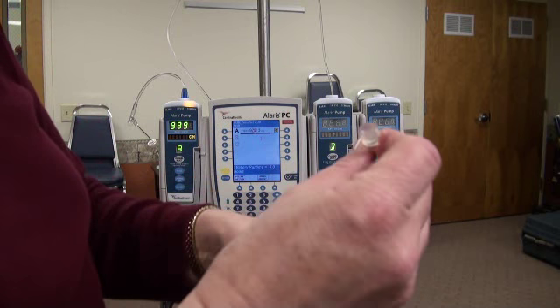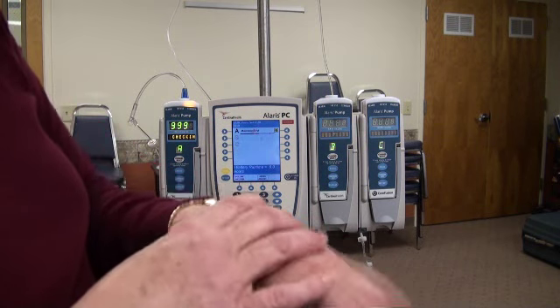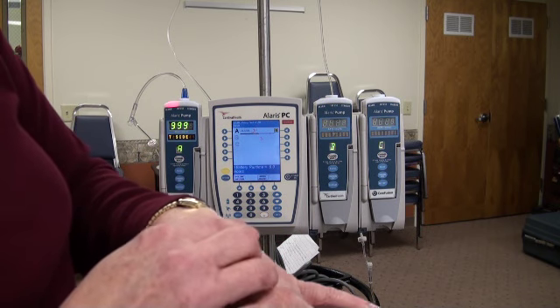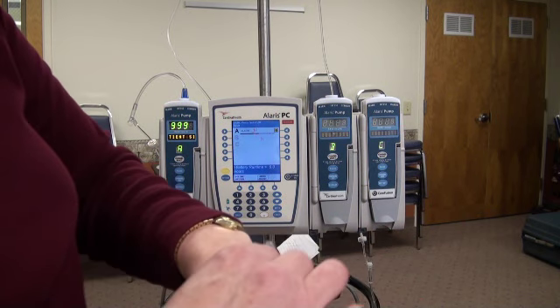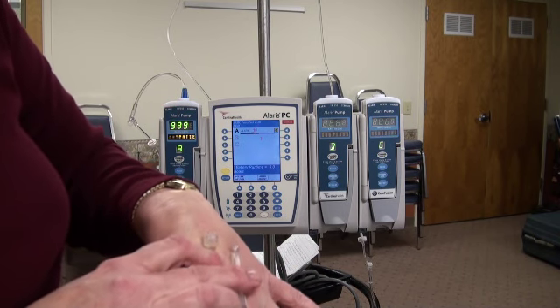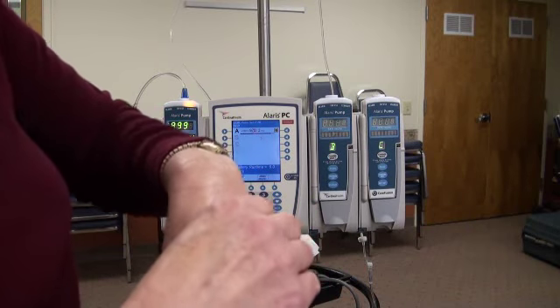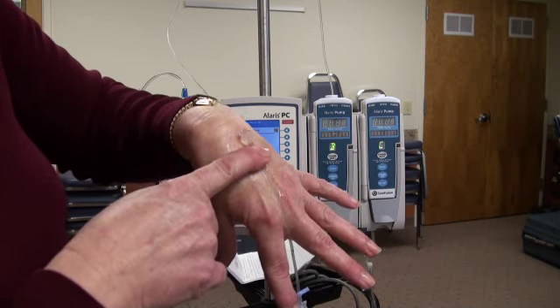We can start looking, and we notice everything looked good. It was touchy. We've corrected that problem. We pulled the IV back a little bit, and here's our occluded patient side again. We notice we have a big kink in the IV tubing now when it's supposed to be running. So we need to straighten out that kink. We straighten the kink out. We hit restart. And here we go. We're running again.